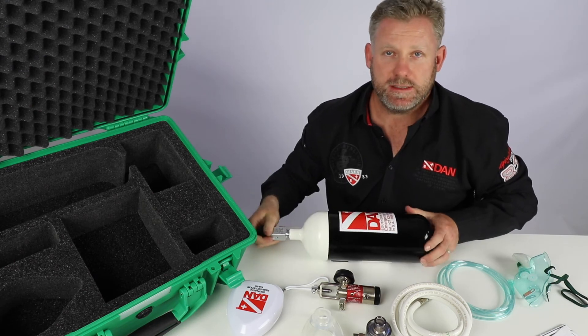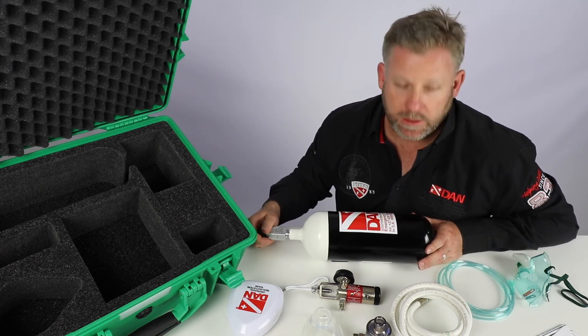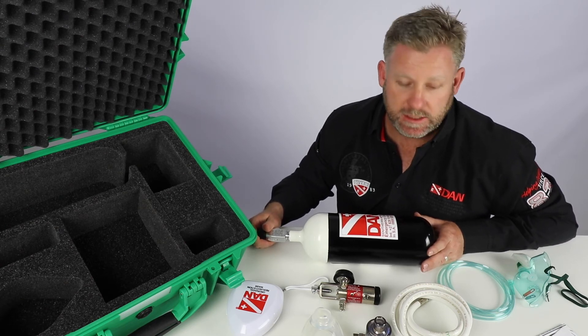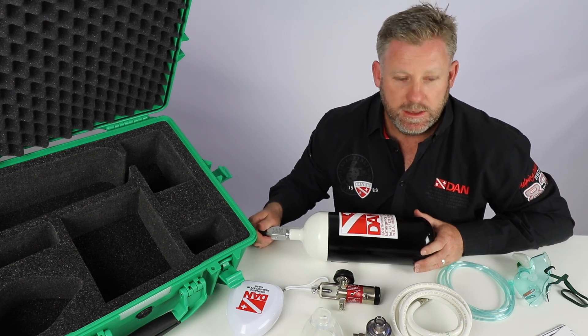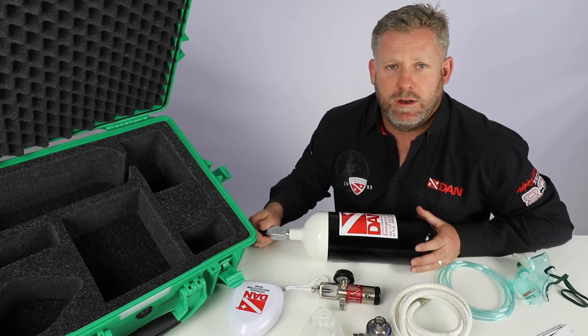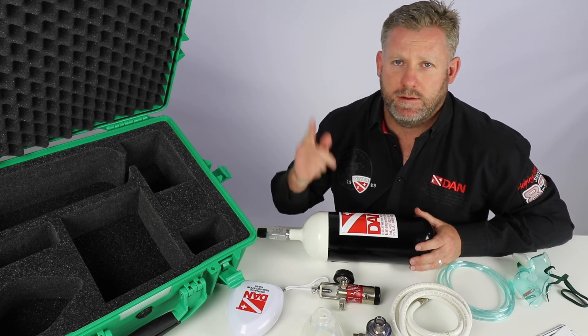So that's the contents of the entire DAN O2 kit. I think it's really good for every diver to have on the boat, or at least every charter should have one of these on their boats — it makes diving a lot safer. We look forward to seeing you guys really soon and remember, it's your safety and your adventure.